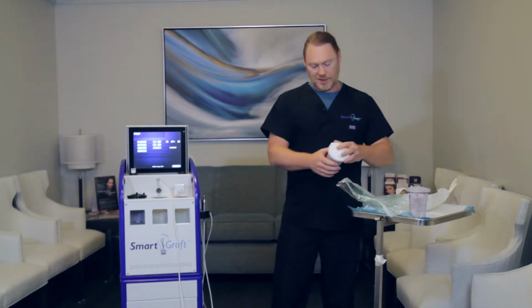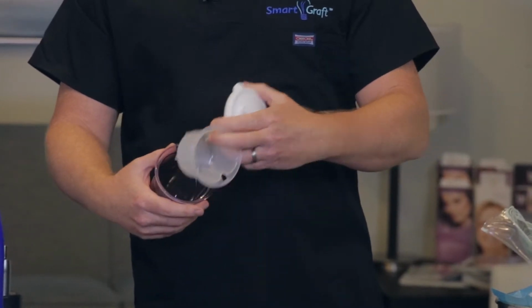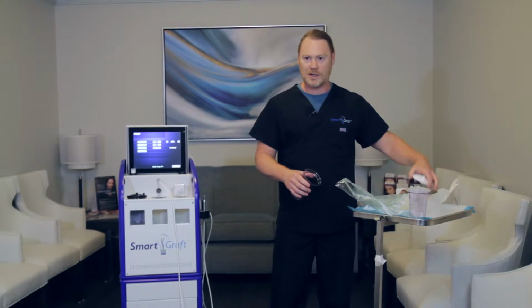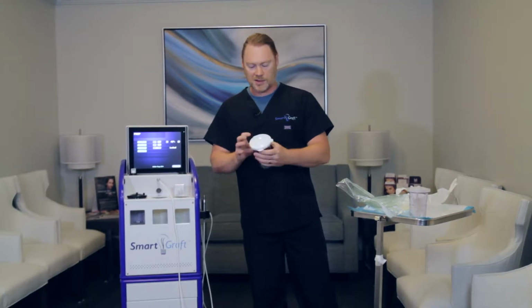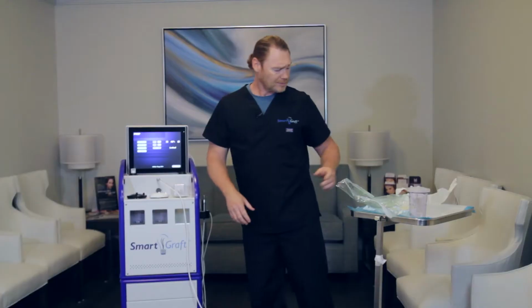The second one in position would be the one with the white lid. Inside it has a second graft canister. You do not need to use this right now. That is just for efficiency of handing off the grafts to the other technicians. You want to make sure these lids are securely tightened and put that one in the middle position.